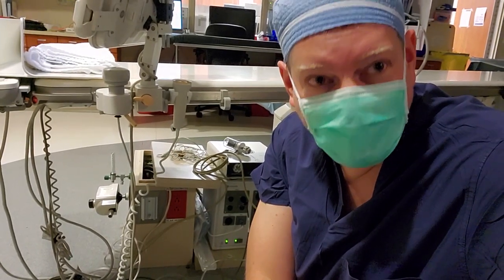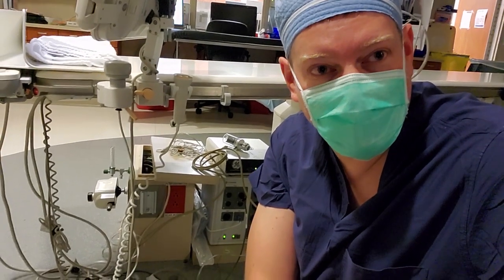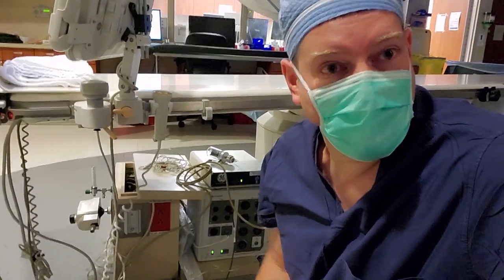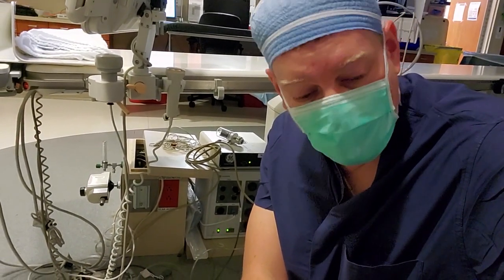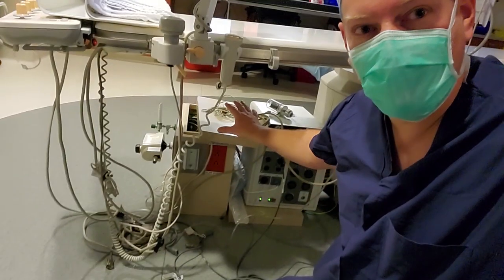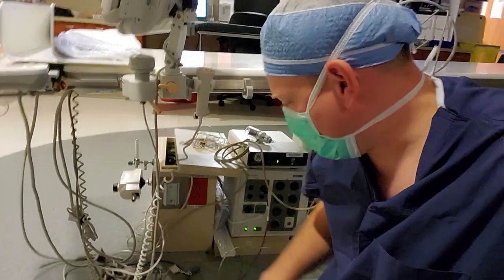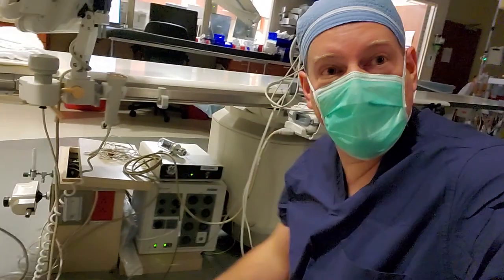Guys, welcome back. Today, I'm in a cath lab. And I'm in a cath lab because this is a high use case scenario of random cabling all over the place. This is the type of environment where cables get damaged all the time if the staff just do not pay attention. We have all sorts of stuff that will get pulled from the floor box and gets attached to amplifiers and etc. We got patient leads and stuff that connect to various places.